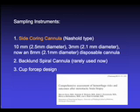A side coring cannula, the so-called Nashold type cannula, is available with 10 mm, 3 mm, now 8, and even now a 5 mm side coring opening. In past years, some investigators and surgeons have used a pituitary cup forceps design or the spiral cannula. We rarely use these devices at present.